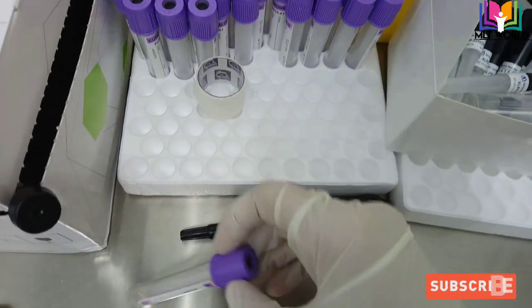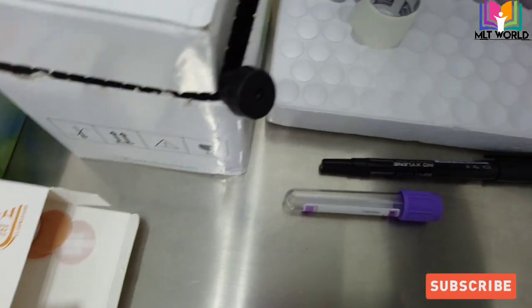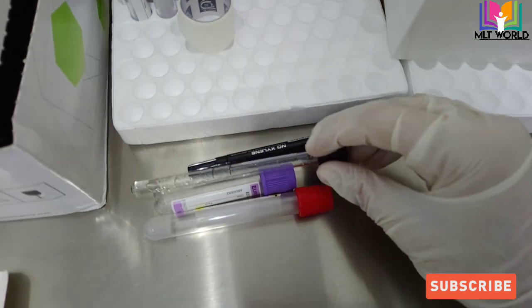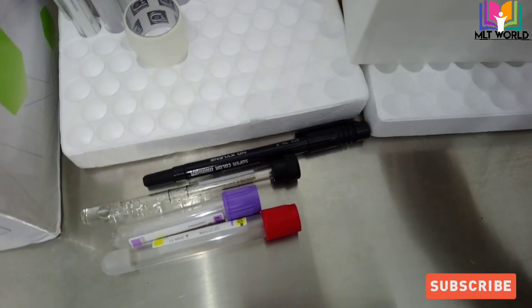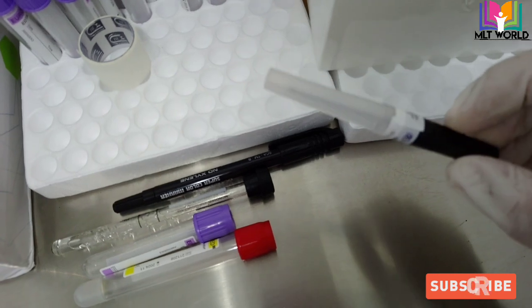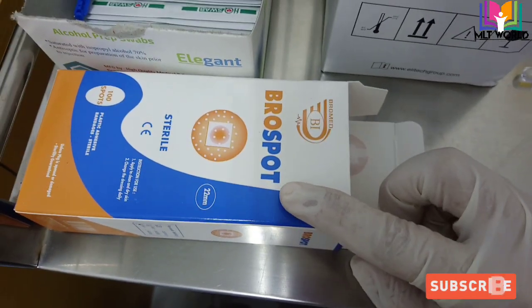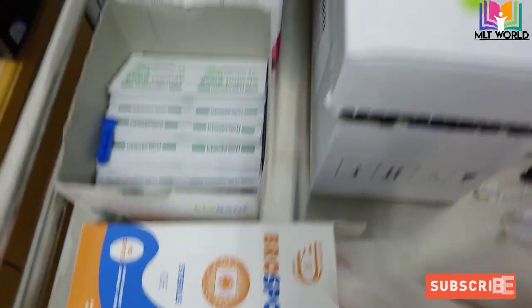With the holder, we can take more tubes — as many as we want. Otherwise, if you have a syringe, you can only take one particular amount, like 5 ml, 3 cc, or 10 cc. With the help of a vacutainer, we can collect more blood.